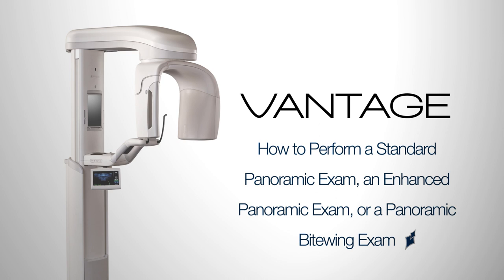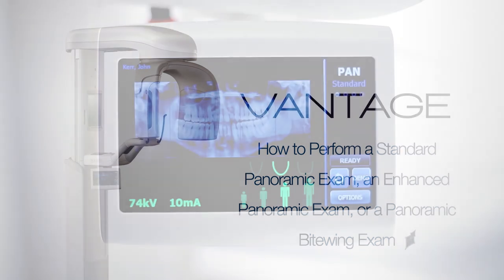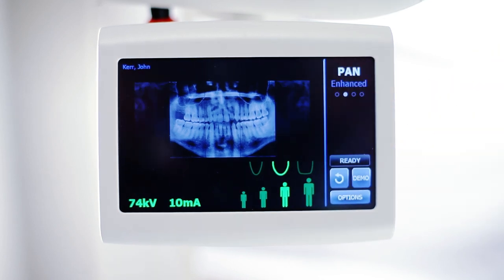How to perform a standard panoramic exam, an enhanced panoramic exam, or a panoramic bite wing exam. Choose a procedure by tapping the Vantage Touch control panel.